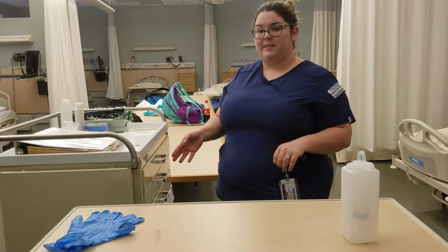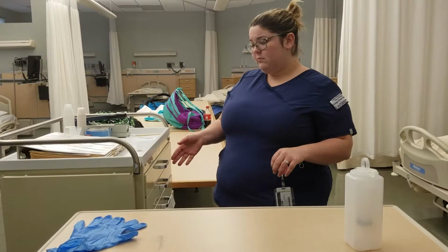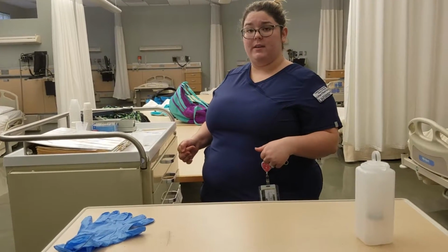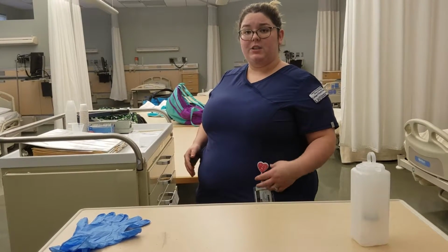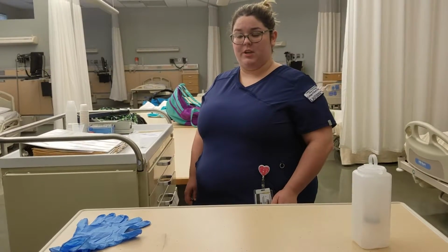After you've checked the placement and you know it's in the proper location, you would make sure that the patient wasn't on suctioning. If they were on suctioning, you would always unhook them from suctioning. And then after administering their medication, you would wait at least 30 minutes before hooking them back up to suctioning.